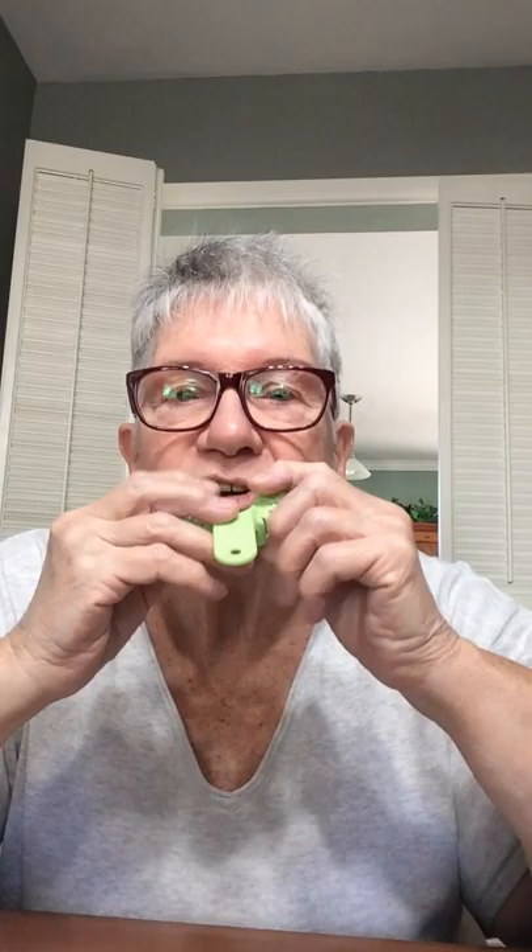So when you have this tray with impression material in it, you're going to turn it upside down, angle it into your mouth, set it down over your jaws, and push down. Then grab a hold of your lip underneath there and pull it out, because you want that muscle to come up and go into there. As it's in there, you press it down, reach in, pull your cheek out on each side, let it go, and then push down and wait until the material stiffens up.